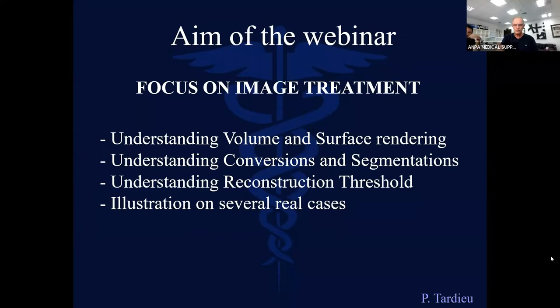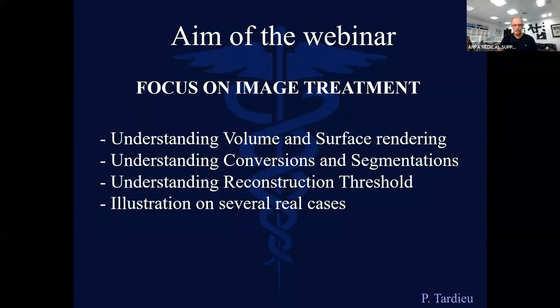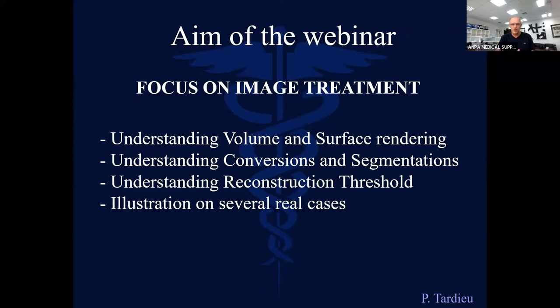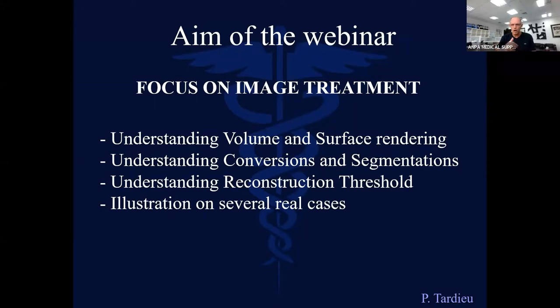I know the threshold and the limitations of a conversion. If the conversion is not good or if there are issues in the native data, we will not be able to work correctly on converted images. Segmentation is cutting a 3D image into small parts — we segment not the 2D image but the 3D image. Arshad is going to help me show how we can segment images and what benefit we get from good segmentation.